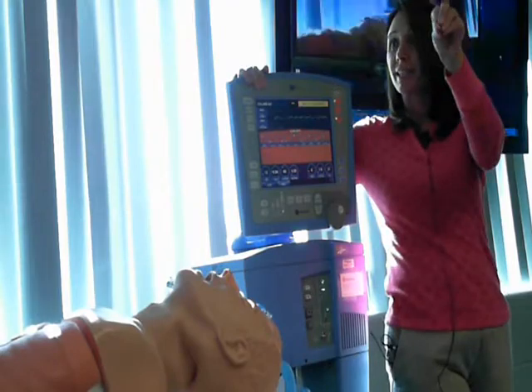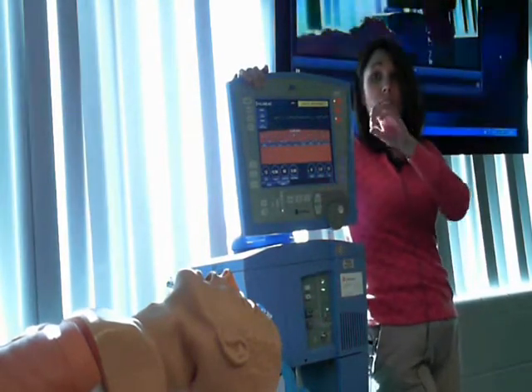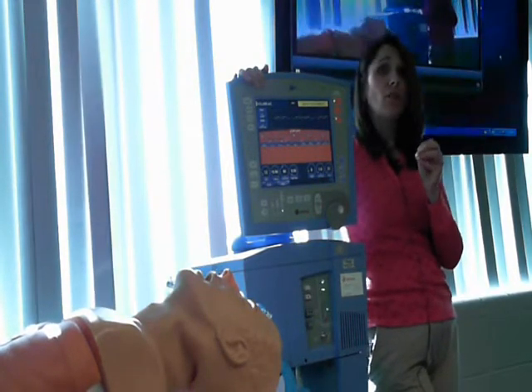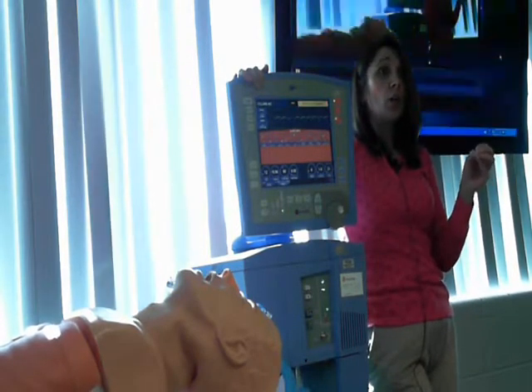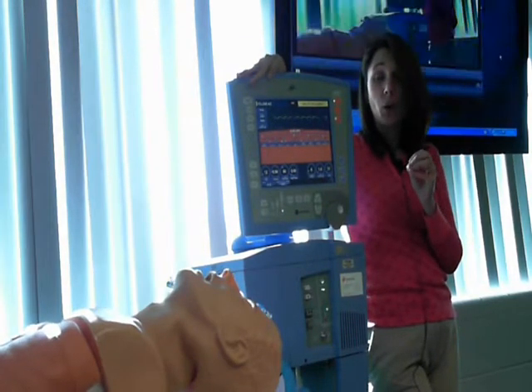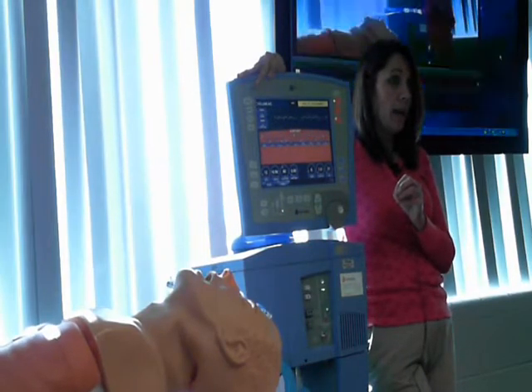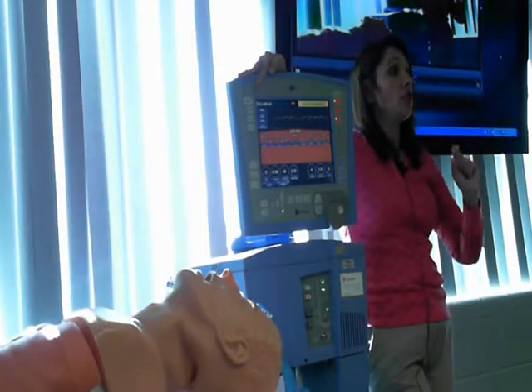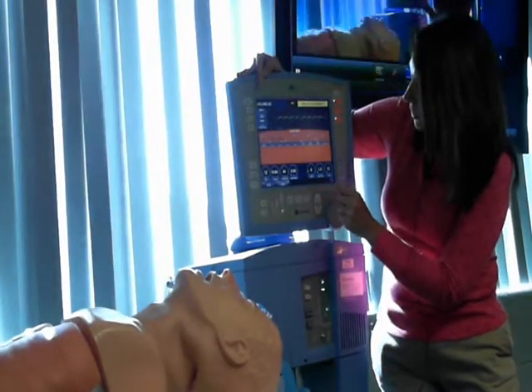But you, as the nurse at the bedside, you need to look at your modes and you need to somewhat understand what's going on, because if you're giving high levels of sedation, high levels of narcotics that could decrease or knock out the respiratory drive, you want to be sure that the therapist has this ventilator set in a way that they can fully support that patient's needs. Okay? So now I'm going to talk about some other modes of mechanical ventilation you're going to see. Let me do a quick little switch here.